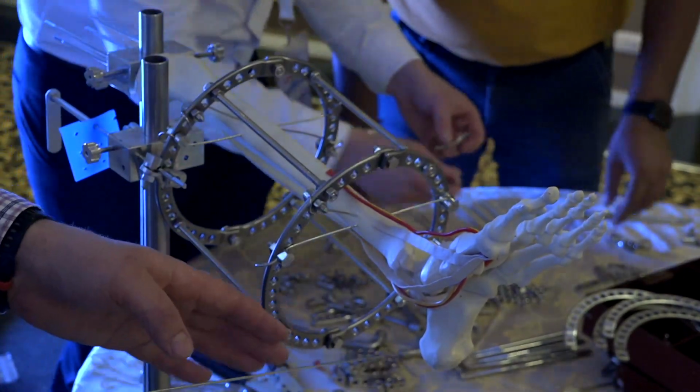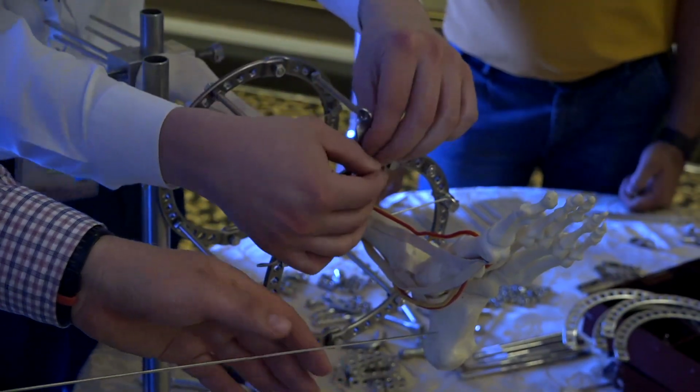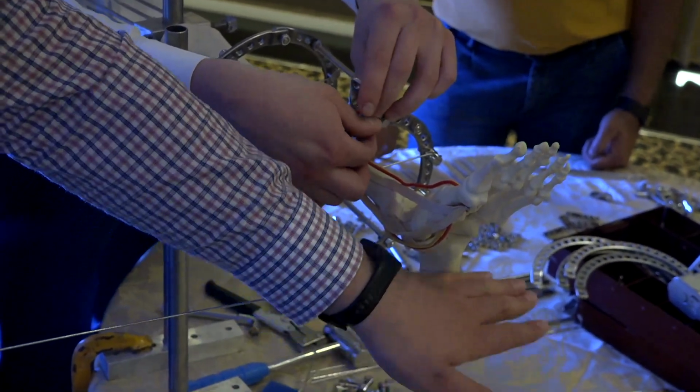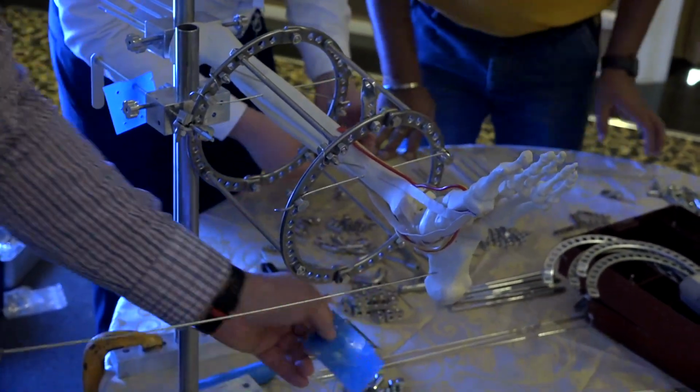I would like to start to put wires from the hind foot, from the calcaneum, and in my experience, I try to put wires only parallel to the axis of the calcaneum bone.